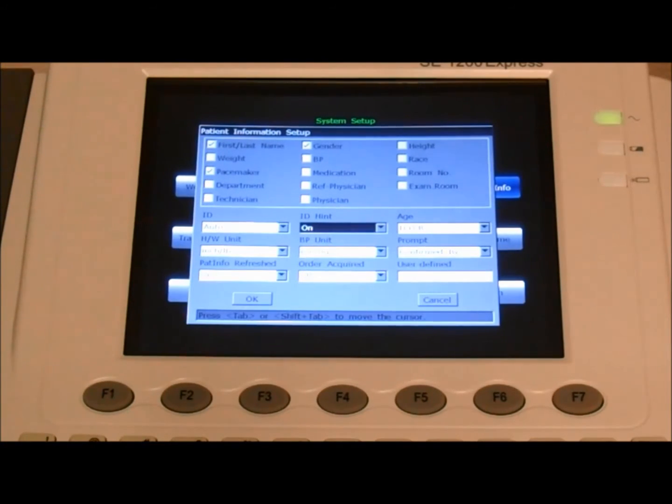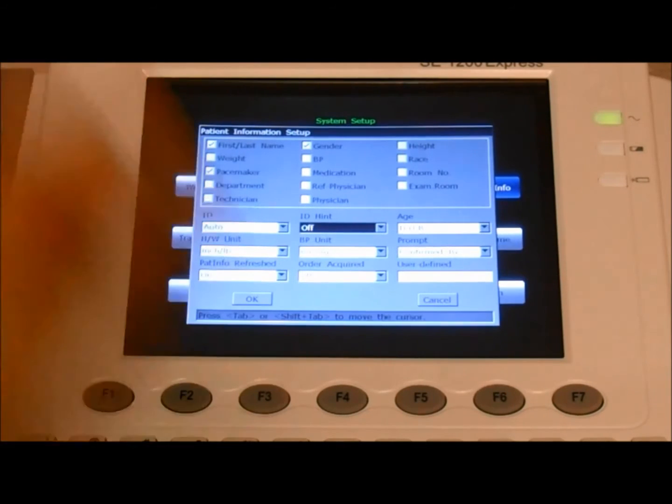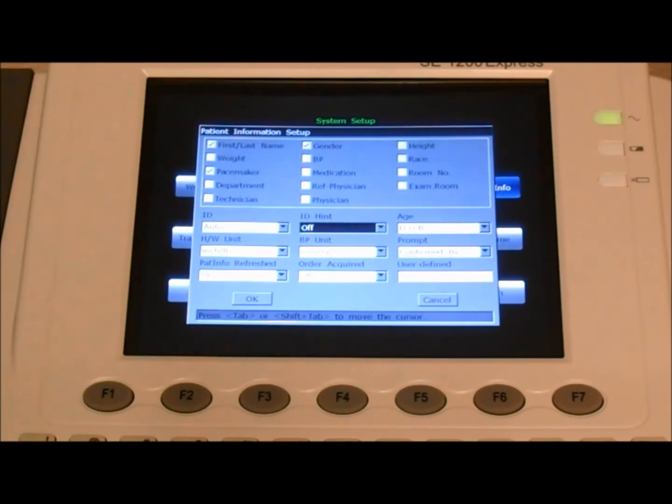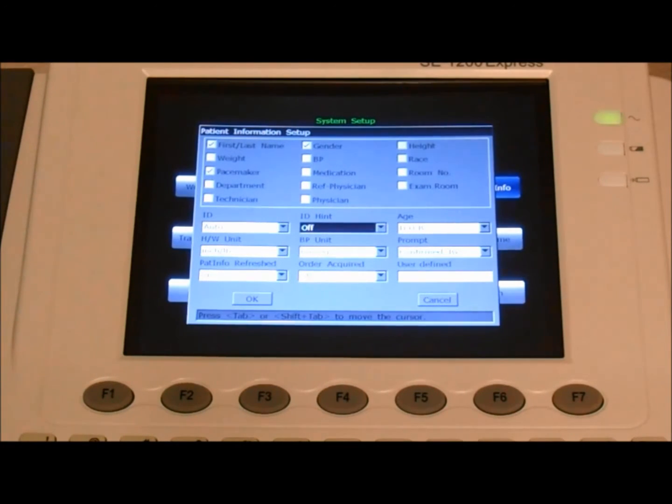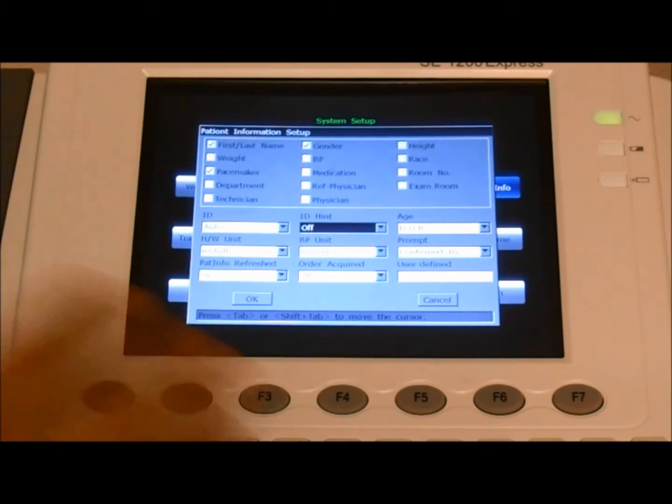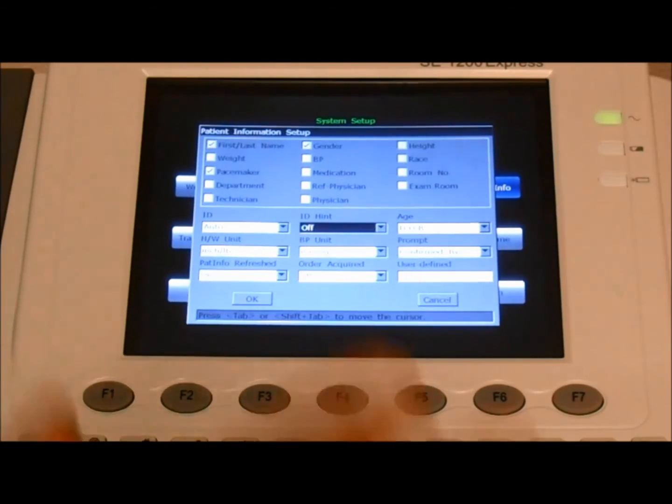If we set it to off, you can go from one patient to the other one without looking at the patient information and to do a test very rapidly and quickly. So after you set your preferences, press enter.